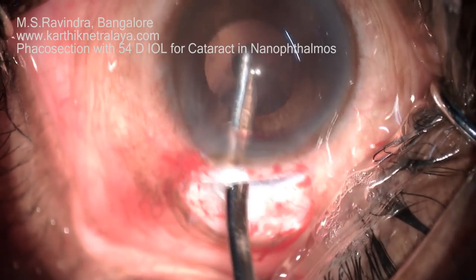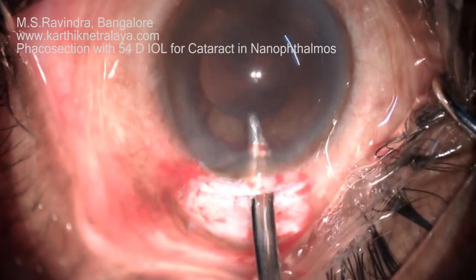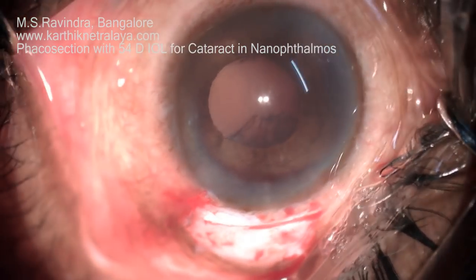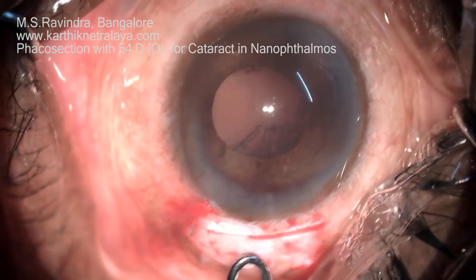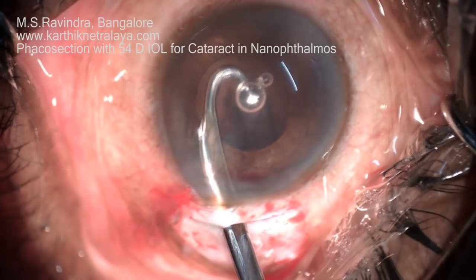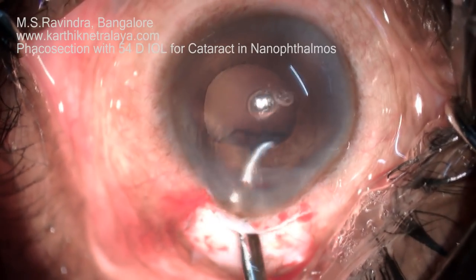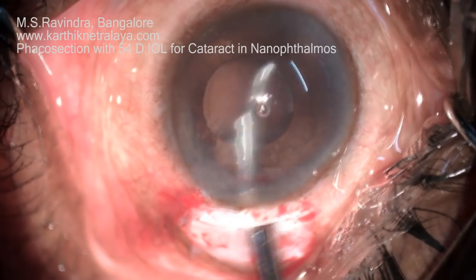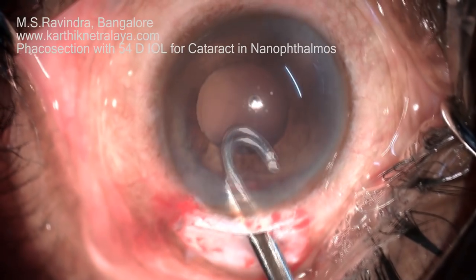Nanophthalmos is known for choroidal effusion and intraoperative high pressure. But with this modified technique, I have performed surgery on many nanophthalmos patients and it is extremely safe — I have never had choroidal effusion, detachment, or intraocular positive pressure in any of these patients.